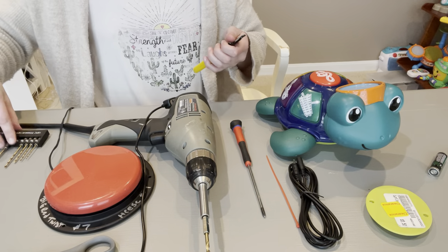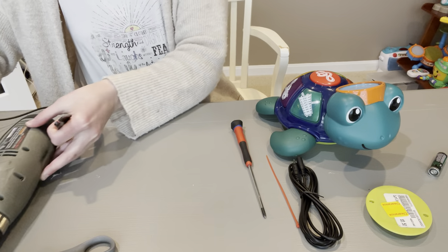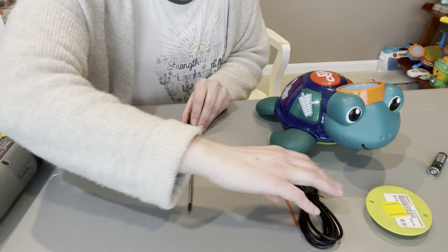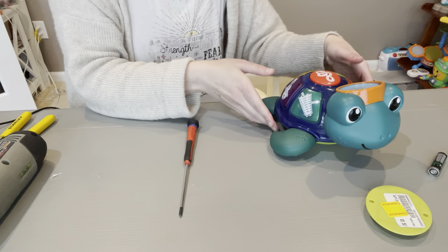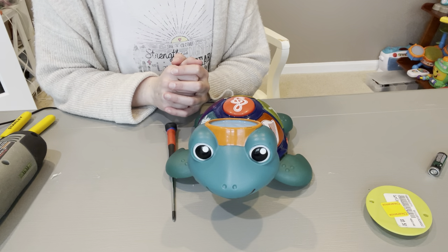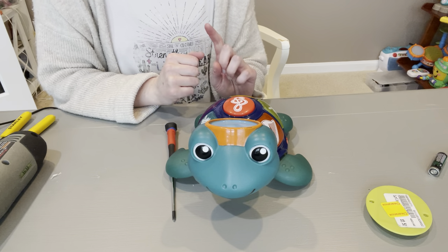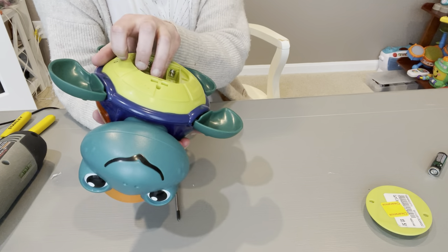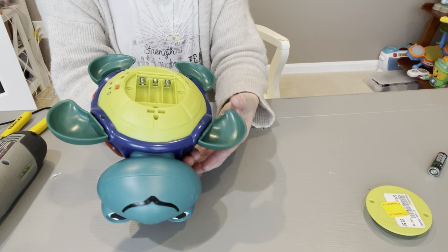Of course, you need your toy, and we're going to go ahead and use our screwdriver. One thing you want to do — this seems very basic — but you always want to make sure your toy works and kind of play with the buttons before you switch it up to anything. If you switch adapt it and it doesn't work, you can rule out that it wasn't the batteries and it wasn't the toy. I did test my toy and I know that it works.